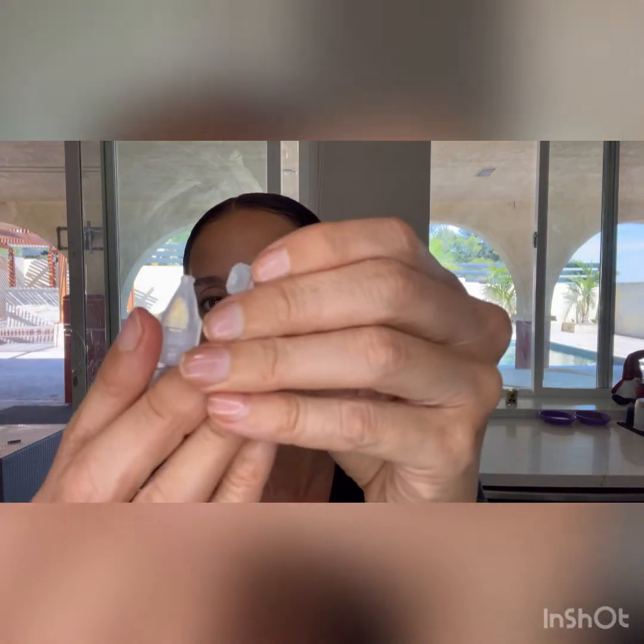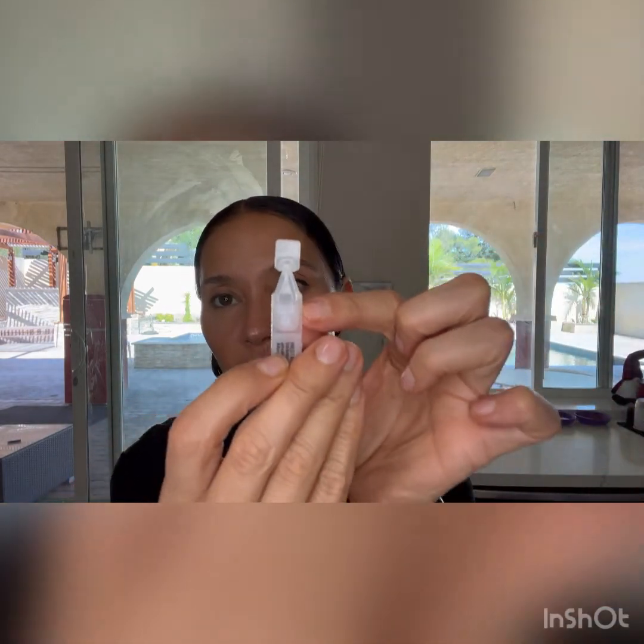I let my patients know that I believe that it is okay to reuse them as long as you're not getting this tip dirty. And the way you can do that, most of them you can actually recap it. So you just push that cap back on, and then see all those drops right there. You can reuse those. And I ask my patients, after 24 hours, probably a good idea to throw it away, because there are no preservatives. Remember, preservatives help prevent any kind of bacterial growth in these drops. So, 24 hours, probably a good time to open up a new one.